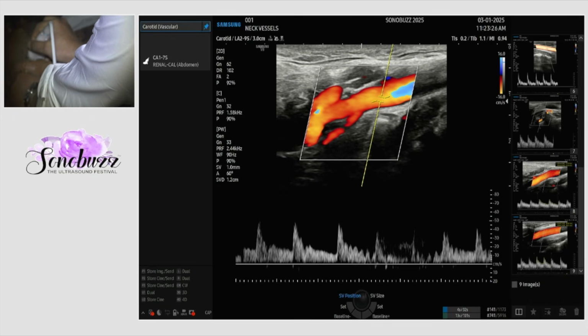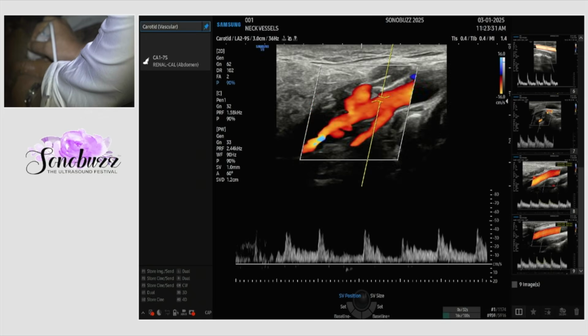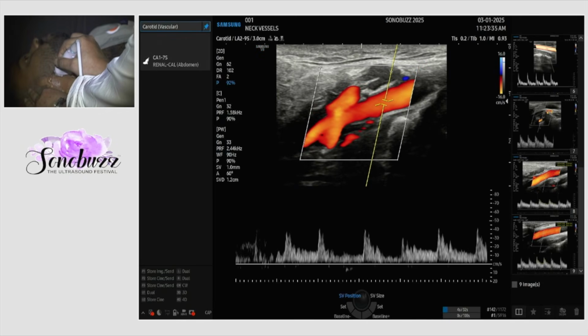Hello, just update for me once. Yeah, okay, so let me be in the artery correctly. Yes, okay. Start again. Yeah, okay.